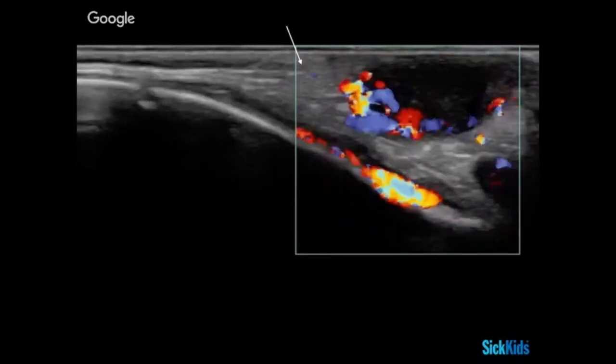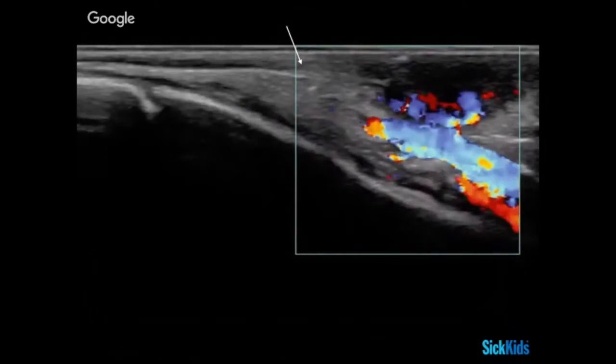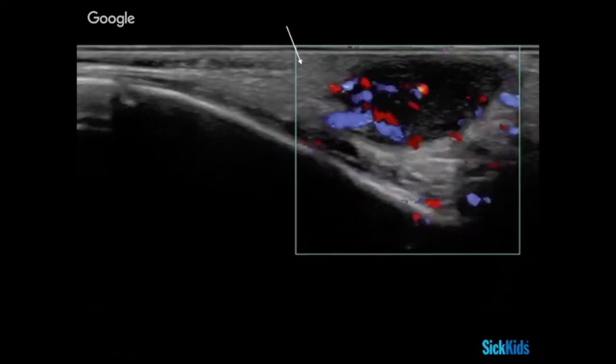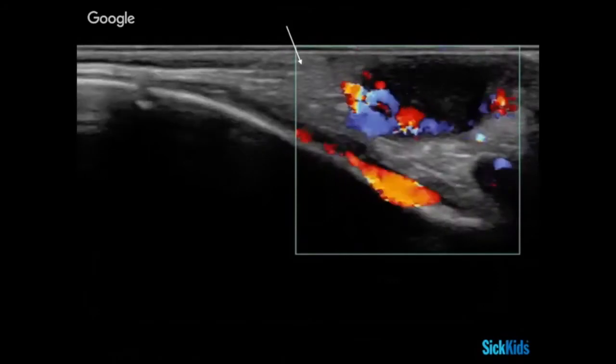What do you think that is, Ben? There's a lot of flow right there. A vessel down there. It's a vessel right there. So is that something you want to cut? No. It's not something I feel comfortable cutting at all. So really important to put your flow on and make sure you know what you're cutting into before you cut. But then could it be a pseudoaneurysm?